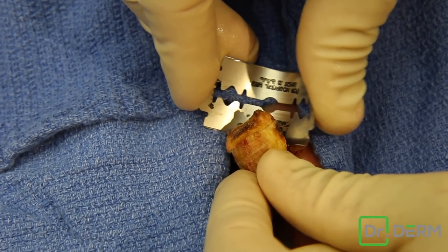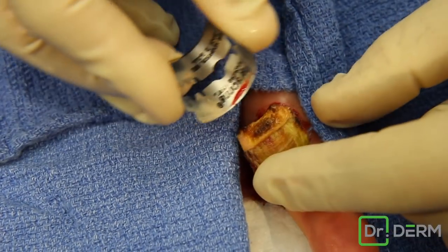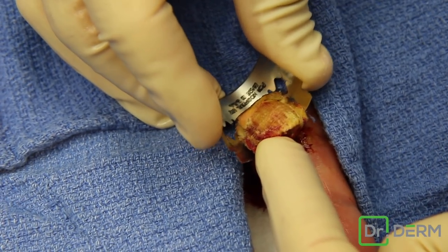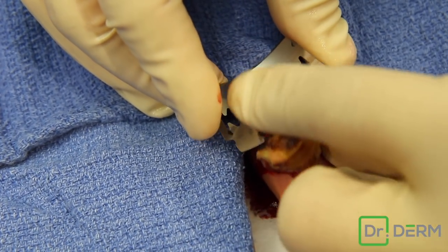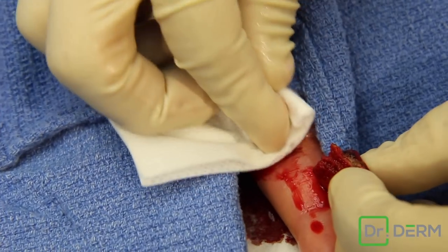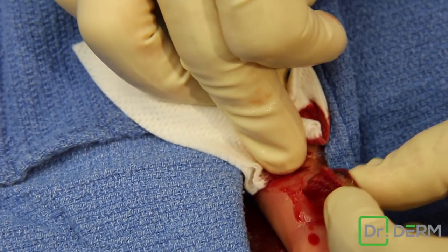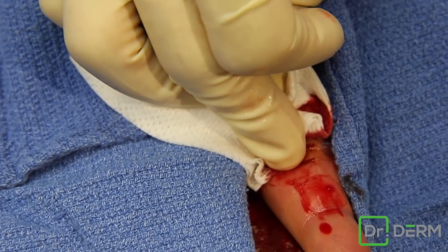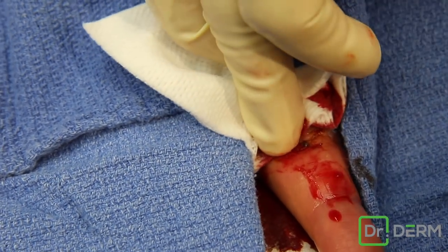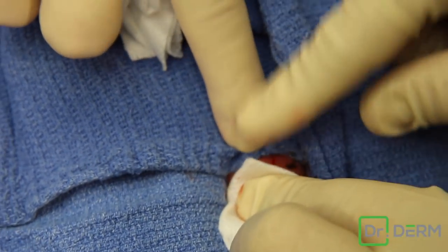These bleed pretty abundantly. This has a little bit of a bandage on it that just won't come off. That big massive thing has just like a pencil eraser defect down there. Is it off? Yeah, it's off. So why don't you see if you just hold right there.